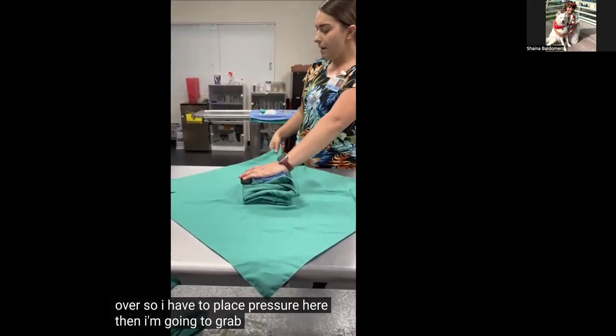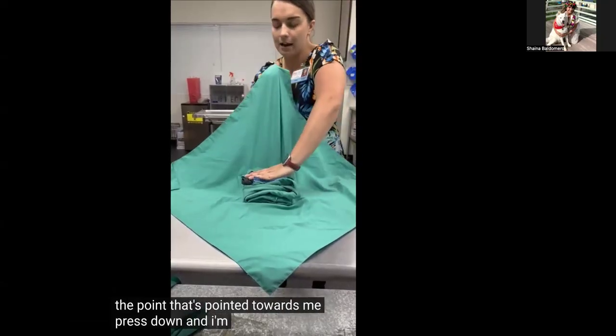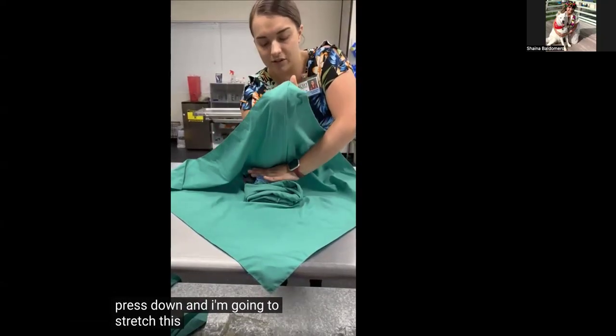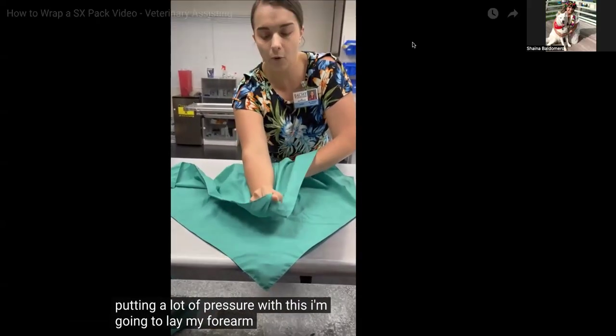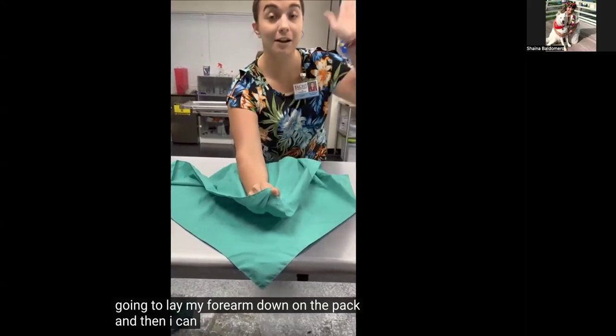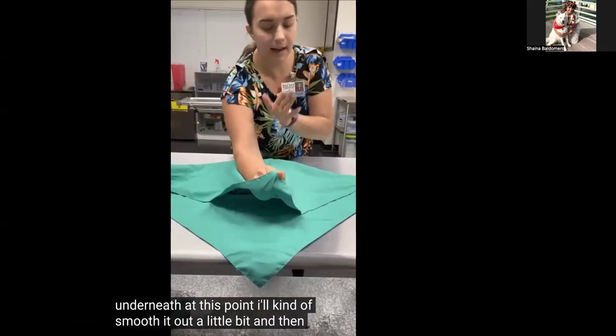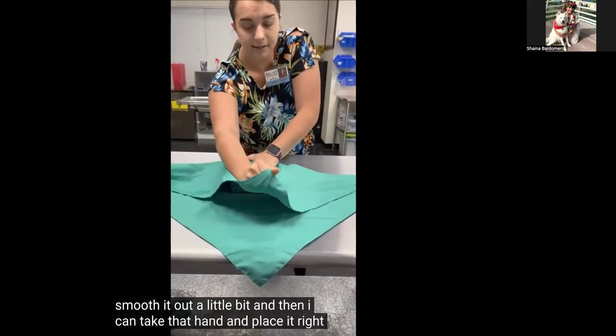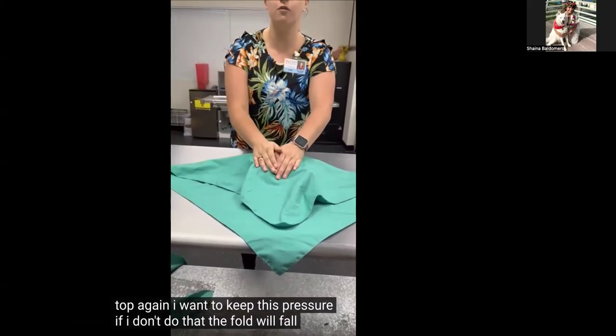Then I'm going to grab the point that's pointed towards me, press down, and I'm going to stretch this drape up and over. I'm putting a lot of pressure with this. I'm going to lay my forearm down on the pack, and then I can remove my hand that's underneath. At this point, I'll smooth it out a little bit, and then I can take that hand and place it right on top. Again, I want to keep this pressure. If I don't do that, the fold will fall out.